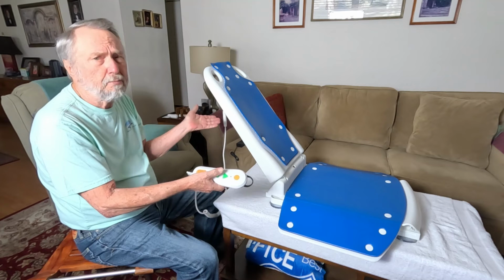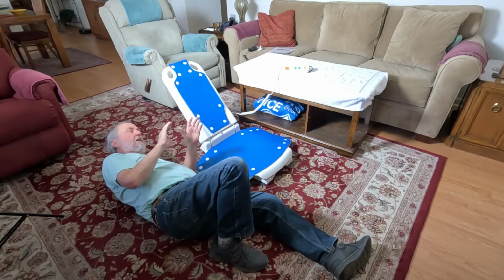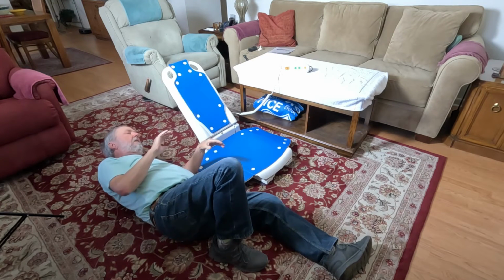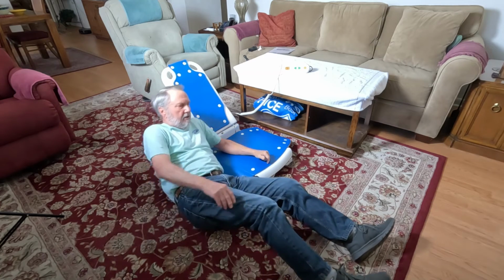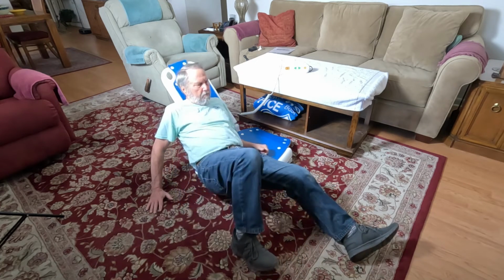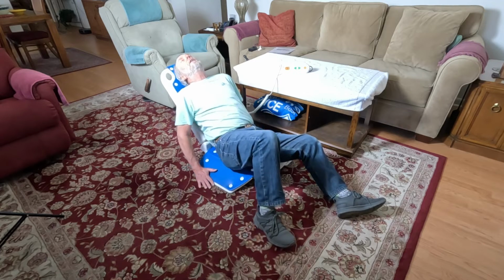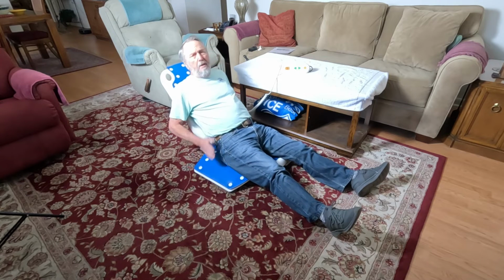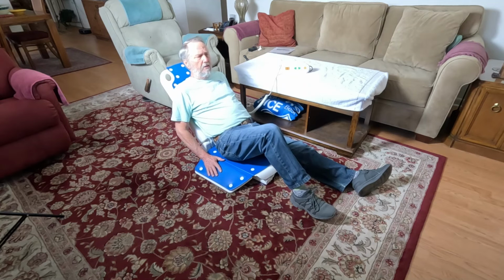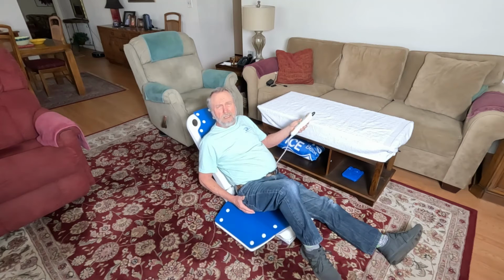And this is the seated position, or the ready position to raise someone off of the floor. And in this position, when they lay it there, then I am going to use this, work my way up to a position, and use the back as a brace to work myself up to where I'm as far on it as I can go. Now I might be in pain, so this may take a while, but I'm in position now to be able to be raised up. I'm ready to lift myself up using the remote control.